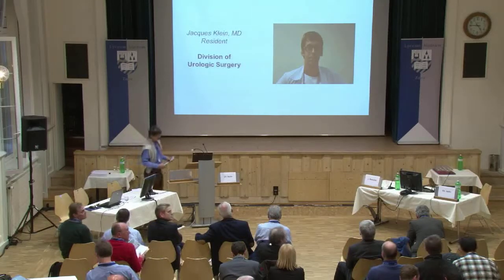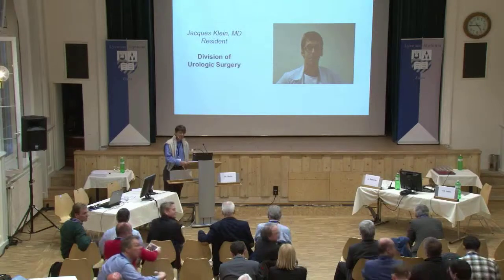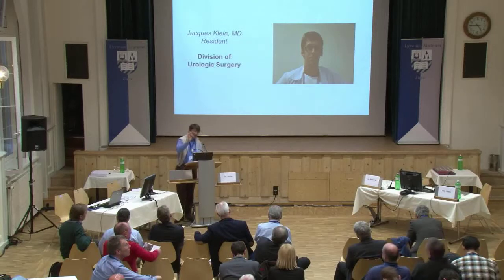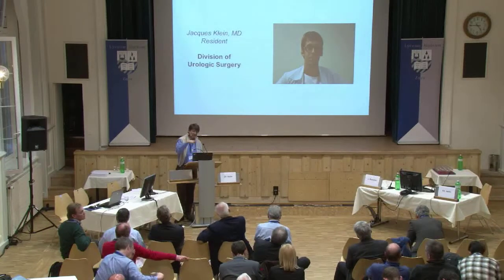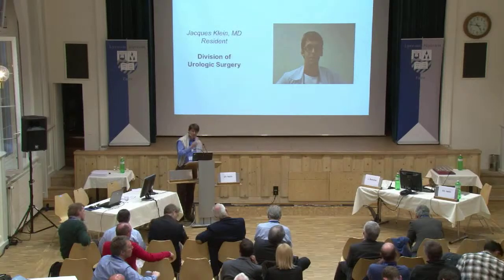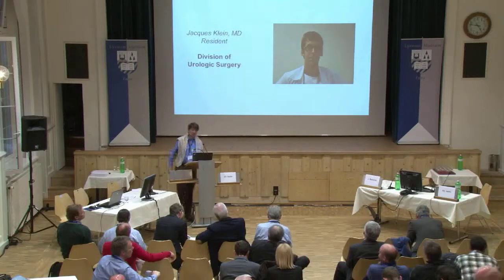One short question. To detect prostate cancer in the transition zone is sometimes difficult, also with MRI. Does PET MRI help to detect prostate cancer in the transition zone? Again, Christian, we have to look specifically at those cancers; I cannot give you the answer. We're working on that. Absolutely, the PET activity is anyway high in the normal tissue of the transition zone, and that's a problem. But as far as I can remember from working on the data, the cancers that were detected had an even higher SUV activity. So if you tailor the SUV activity according to the zone you're looking at, meaning the peripheral zone, the SUV should not be so high to show cancer, but for the transition zone, it's much higher. Then you could probably get good information for the transition zone.